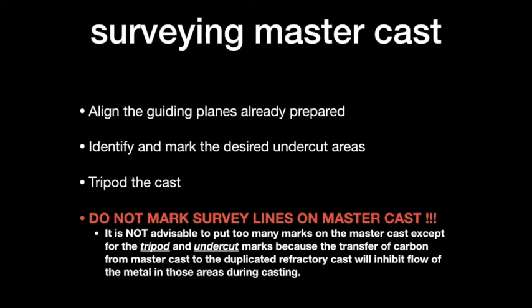Later on, you will need to tripod the master cast and send it to the lab so the lab technician can follow your design to make the framework. Here, the only difference between surveying the diagnostic cast and the master cast is that you do not mark the survey line on the master cast. You only mark the tripod points and the desired undercut mark on the master cast.